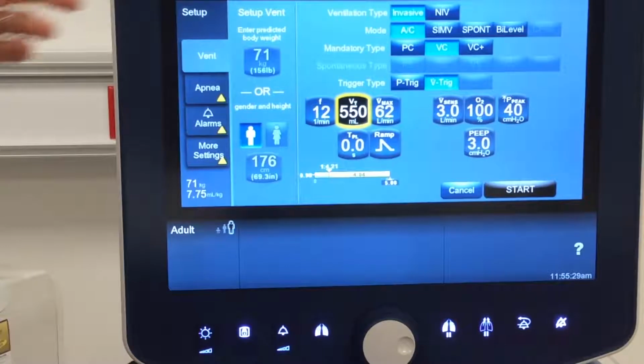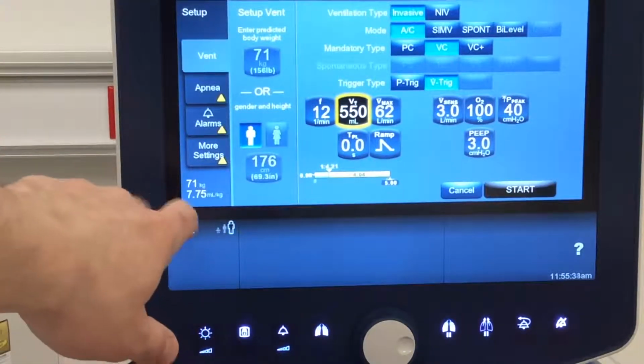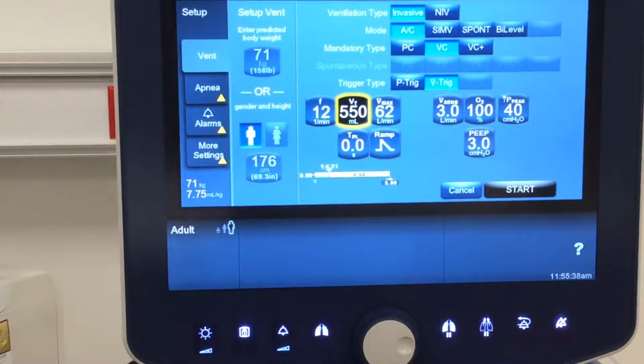Okay, one cool thing I do want to show you here while we're talking about tidal volume is down here in this bottom left-hand part of the screen, it shows me my patient's ideal body weight, and it shows me the mils per kilo I will be giving. This is very useful when you step into a room and you maybe don't have this type of information fresh on hand or anything like that.